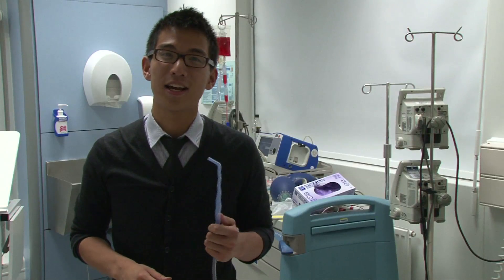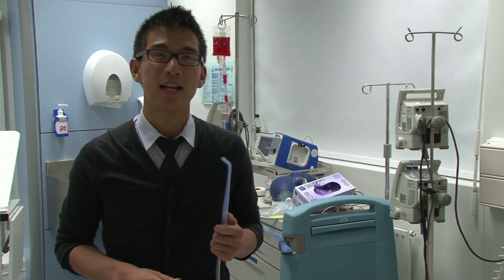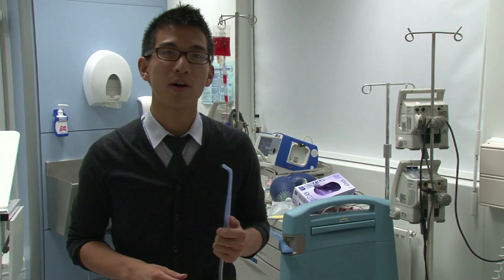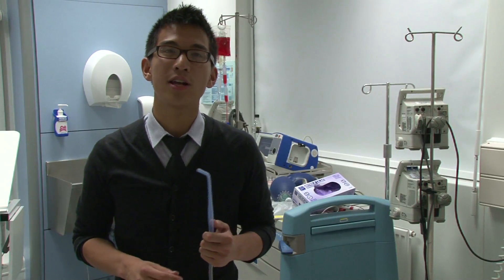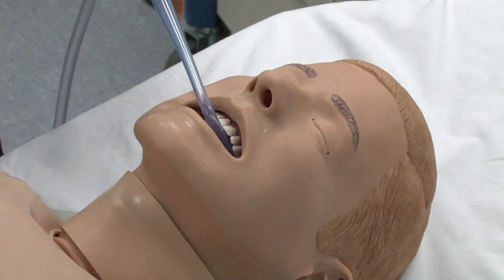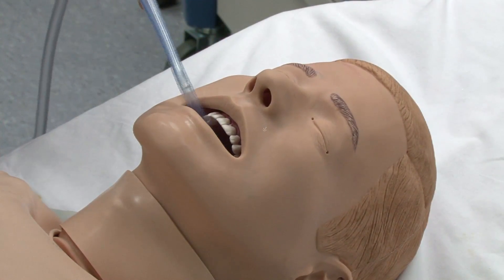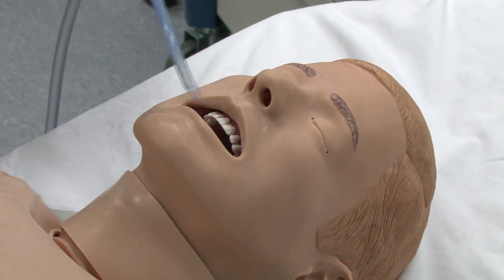This is the yankauer sucker. This is used to clear excess vomit and secretions from the mouth. You should only ever attempt to clear secretions which you can see, and never insert the instrument further than you can see.